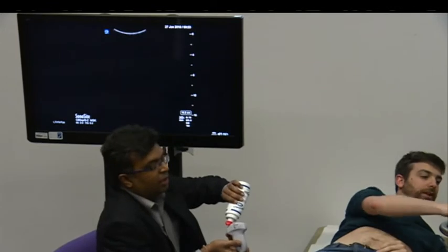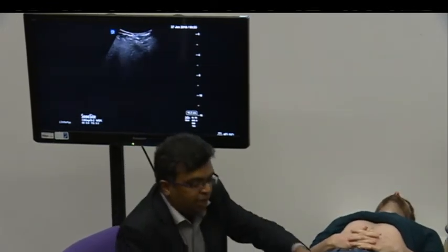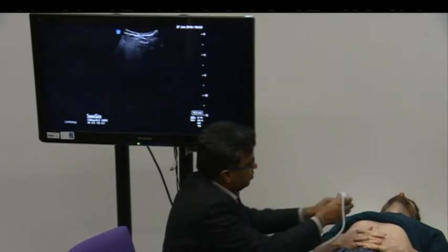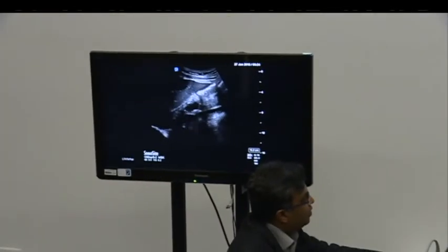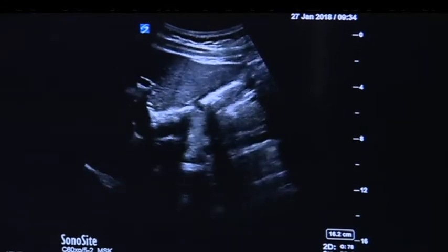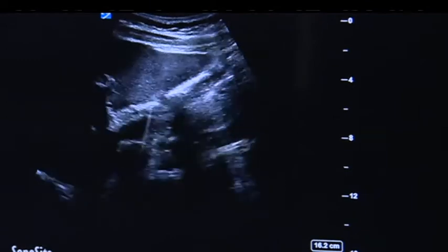What you will see now is that he has had some water, but usually when we drink something we swallow some air as well, so we'll see the air bubbling through the stomach now. There is a lot of air inside the stomach, so the clear boundaries are not seen. We'll wait for that to settle - at the moment it is whitish, so we'll wait a few more minutes.